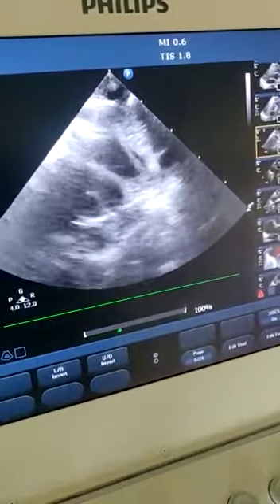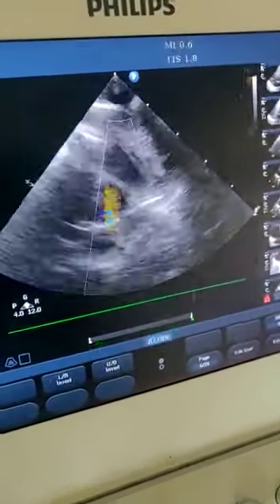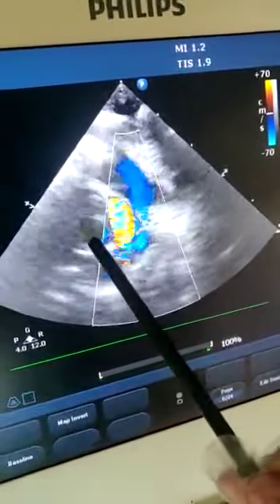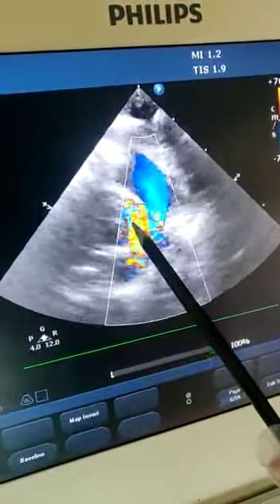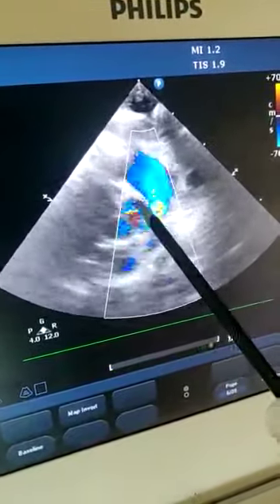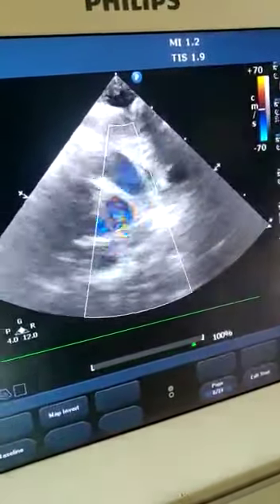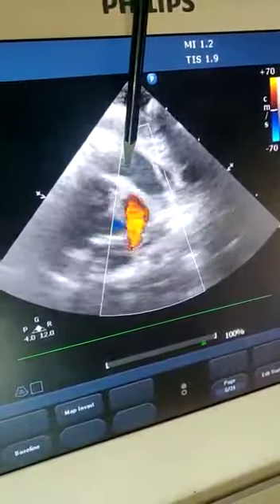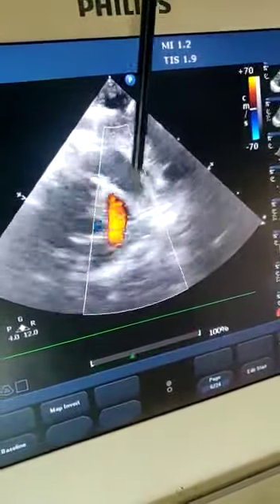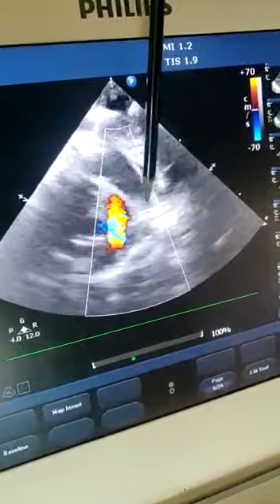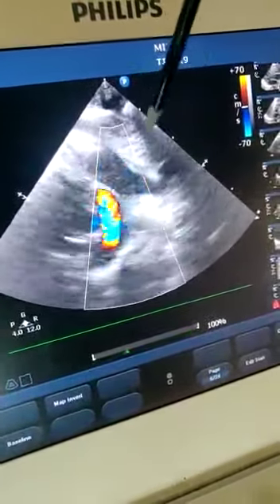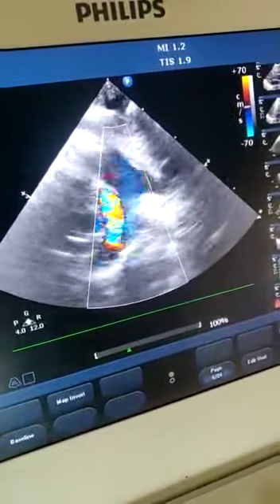On color Doppler you can see the left ventricle opening into the pulmonary artery. You can appreciate the right and left pulmonary artery and the ductus arteriosus. You see the right ventricle opening directly into the aorta — there is no branching. So this is the view of transposition of great vessels on modified parasternal long axis.